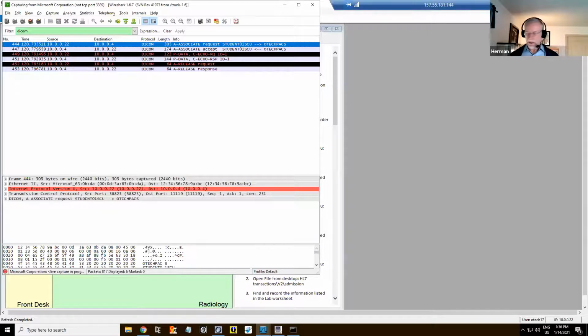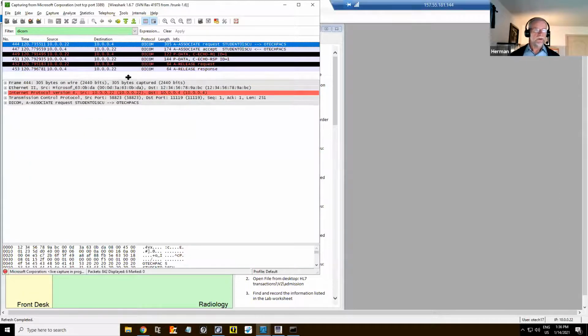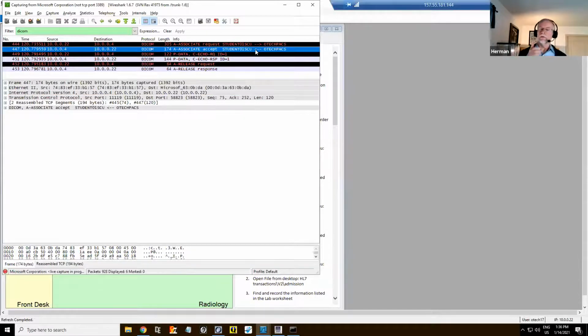Right? So let's first look at the top, and I realize it's a little bit hard to see for you guys, but I'll tell you what's going on here. So we had a time of 120.73 and so on, right? And transaction number 444. There was a request from student, so the virtual machine, to OTAG PACS, an associate request. The second line was an associate accept. Good, so that was good news. We already accepted. So we have made a connection.